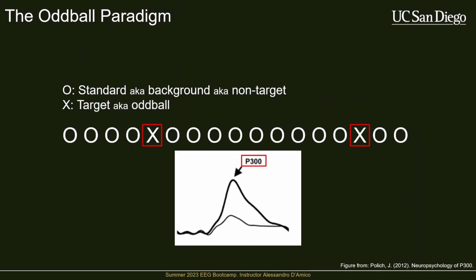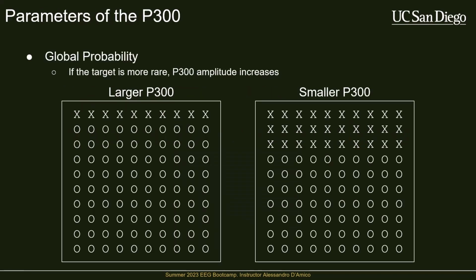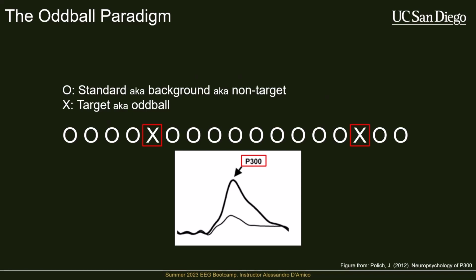And in reality, I think this figure shows it well. You'll also typically get a P300 response on average from your non-target stimuli as well. It's just considerably smaller. And you can design your experiment to sort of make this more or less of a problem, but you will usually see this P300 response in both scenarios. But it's typically very, very obvious which one is your target versus your non-target on average. Again, at the single trial level, you typically don't see anything in the non-targets, but as you average out tons and tons of trials. So I'll address this.